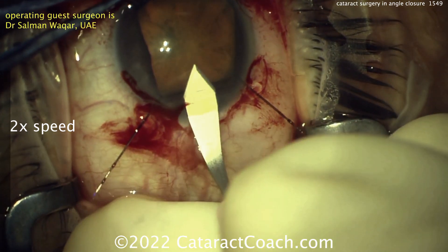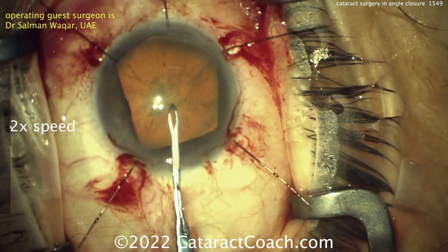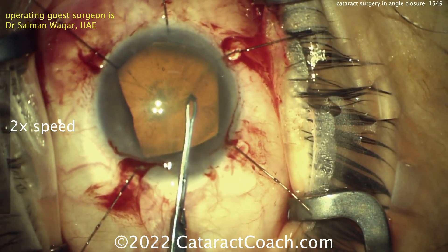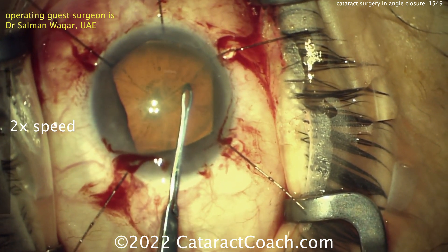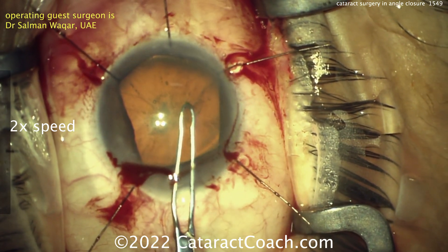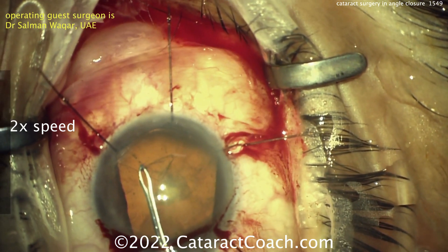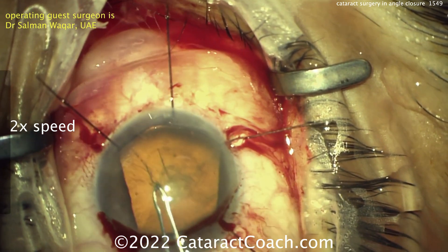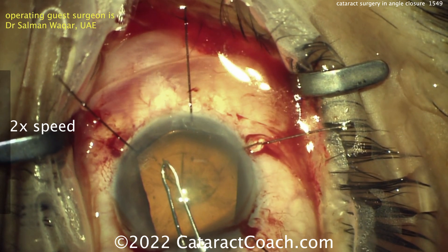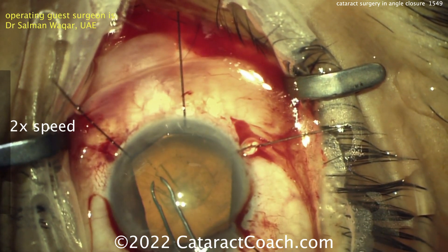Here's the incision. I like the long incision length, which is helpful here. More viscoelastic. Now getting the capsulorhexis done — going to be tough here with a very shallow anterior chamber. You can try some extra heavy cohesive viscoelastics or one of those viscoadaptive ones. That can help. You can also use a smaller forceps like he's doing here, being very careful not to gape or destroy the incision.